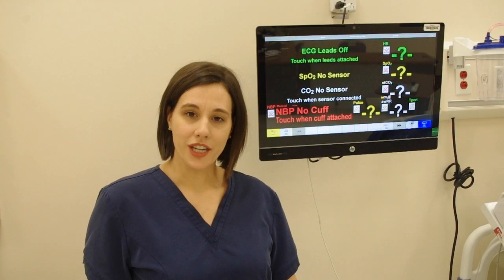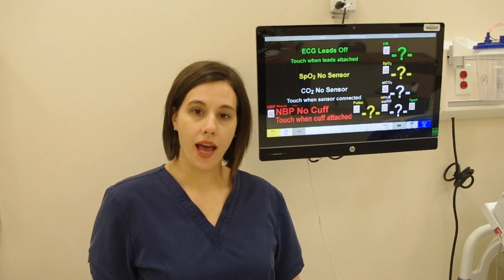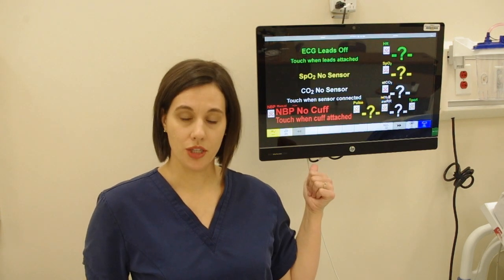Everybody, welcome to the Jefferson State Community College Simulation Lab. Today I want to talk to you about how to use the Laerdal patient monitors.